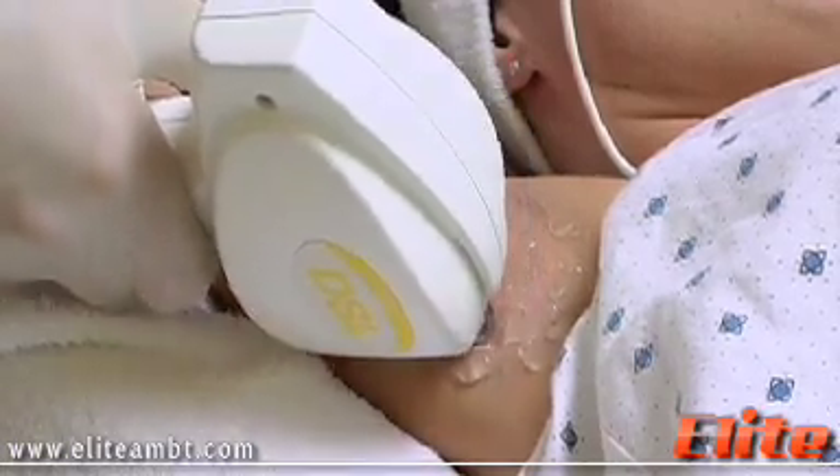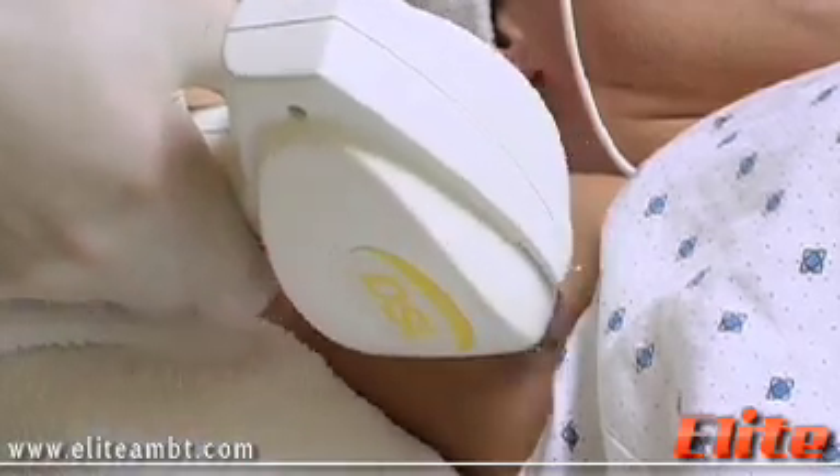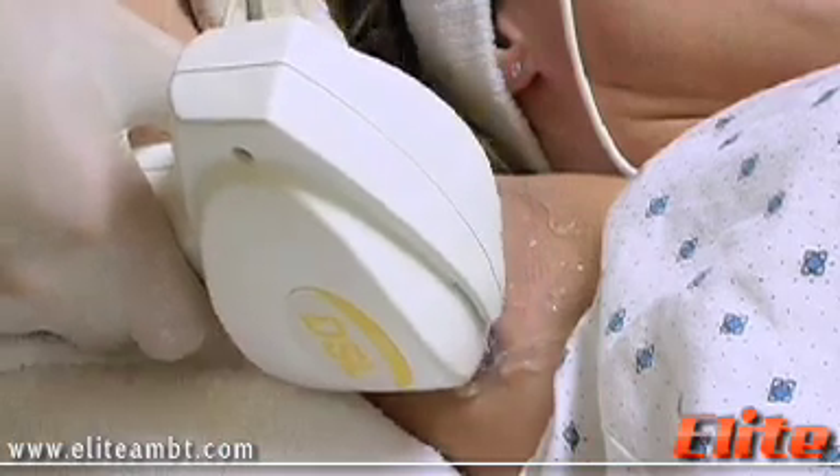It usually takes about six treatments to get permanent results since hair grows in three phases. And we're almost halfway since we covered the area with one single pass.